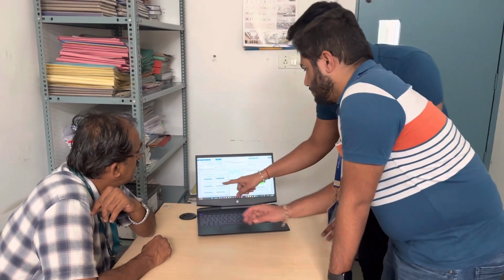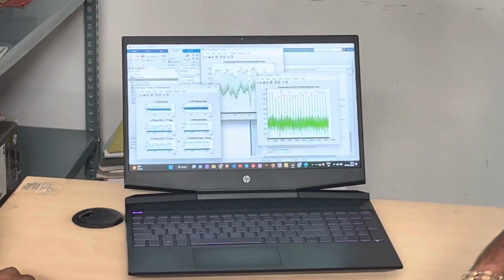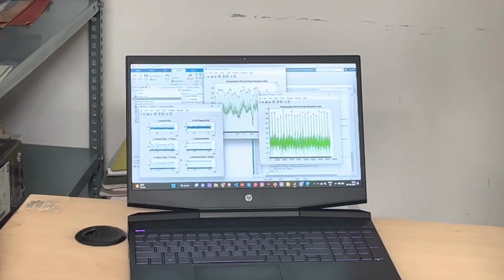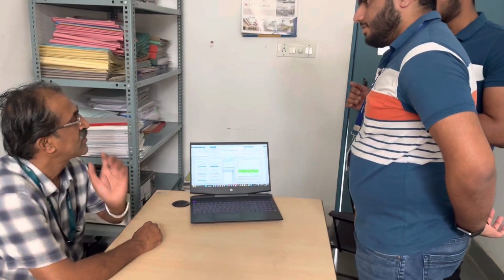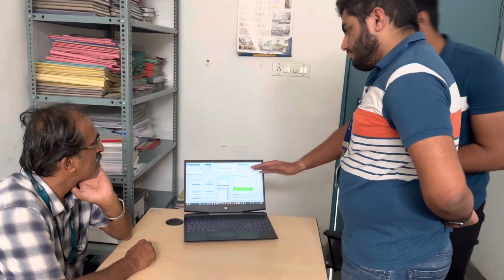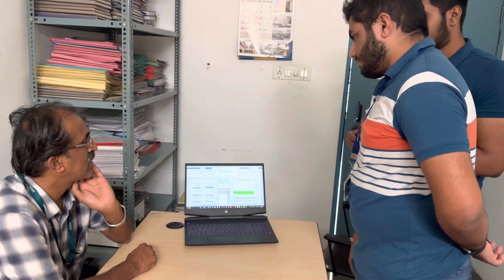Then after that, what else have you done here? This is the detected peaks. This is the filtered ECG second phase. If we need more accuracy, we keep filtering again and again, by reducing the height of the rectangular component. This is the filter window, sir.